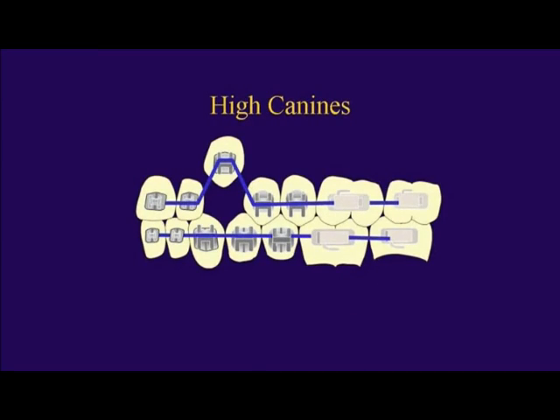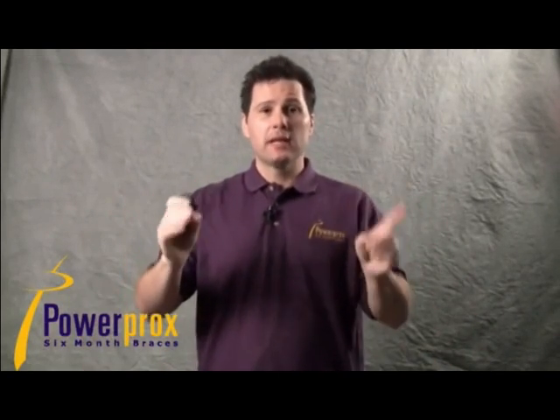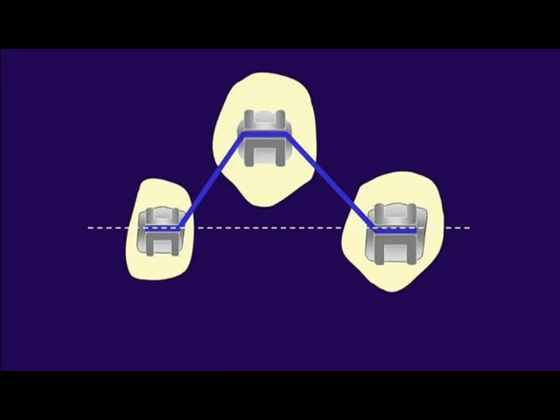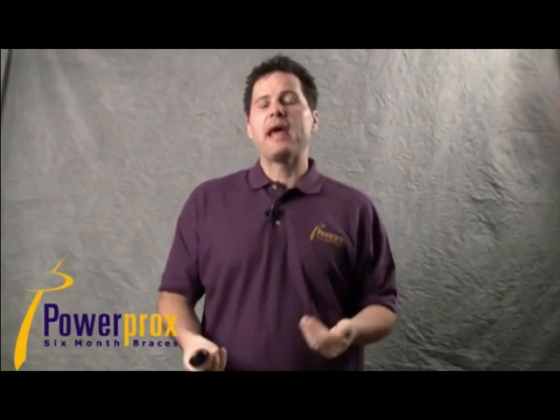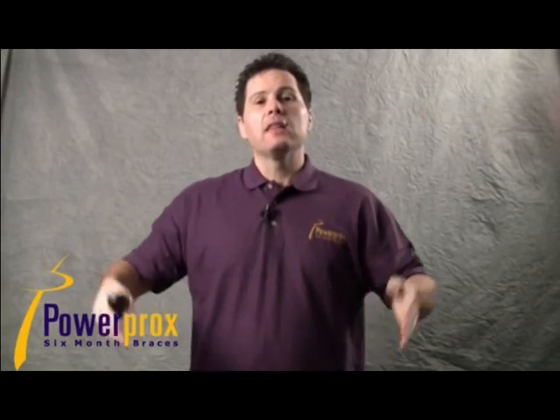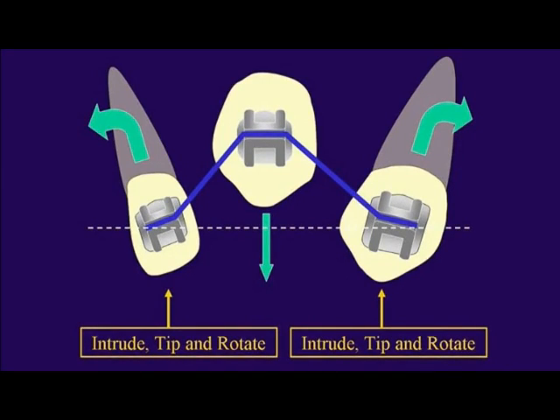This is the wrong way to go after a high canine. Do not go after a high canine with continuous nickel titanium arch wire. Because what's going to happen as that canine extrudes, comes down, the adjacent teeth, the lateral and first bicuspid, can intrude, tip, and rotate. The canine is a very strong tooth, has a lot of anchorage power.